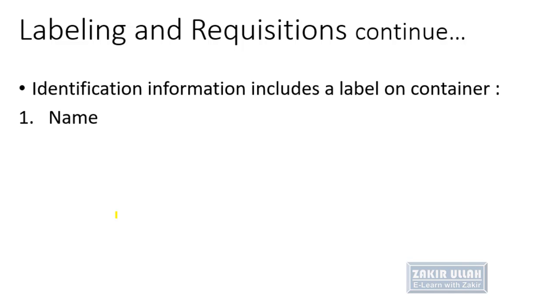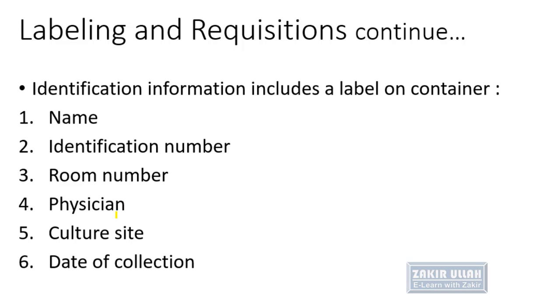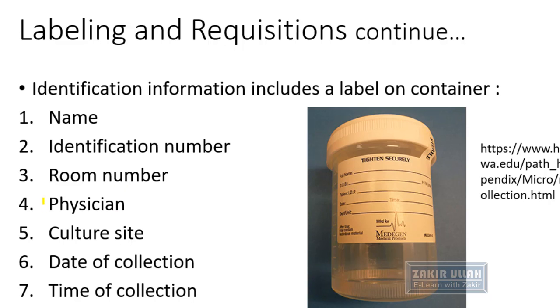In certain cases the name is not mentioned, so the hospital identification number or lab identification number, the ward number or room number along with the bed number, the physician who is treating the patient, who has referred the patient and advised the test, from which body site the culture or sample is taken, the date of collection, and the time of collection.